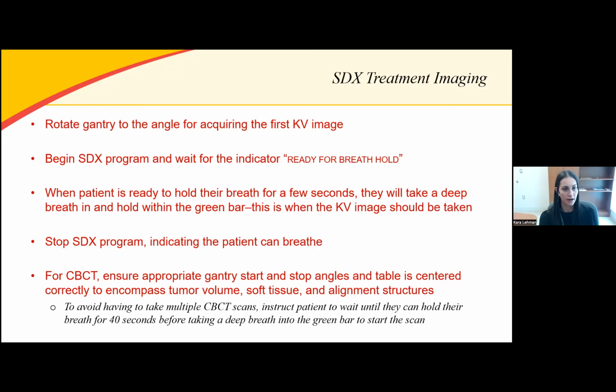At this point, I would just be mindful as a therapist to be communicating to your patient pretty well about how long you need them to hold for the specific imaging that you're going to be doing. For example, our KV images really only take 5 to 10 seconds. So if you let the patient know that, then they know they don't need to hold their breath for that long. Whenever they see that green bar turn on, they can pretty much take a deep breath in and hold.